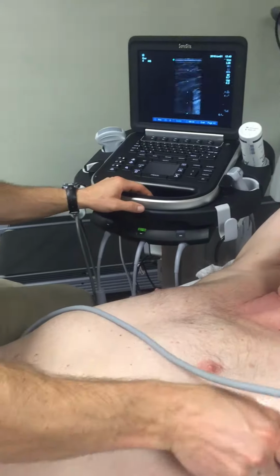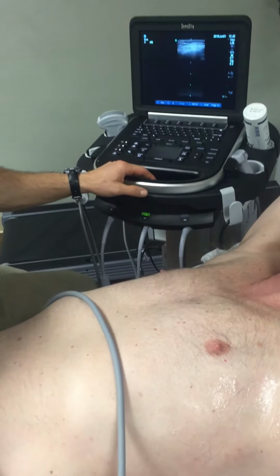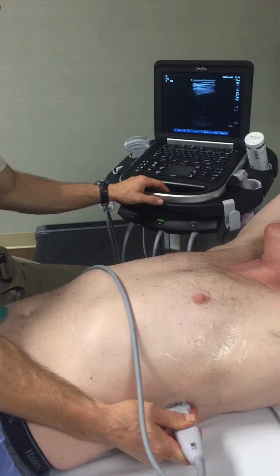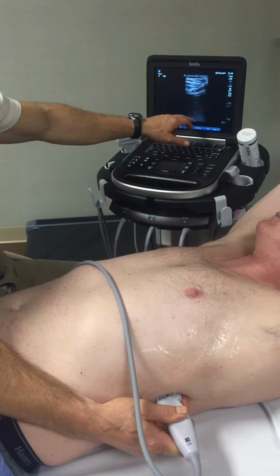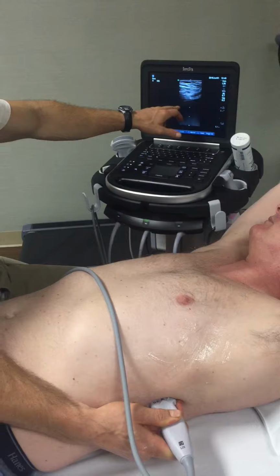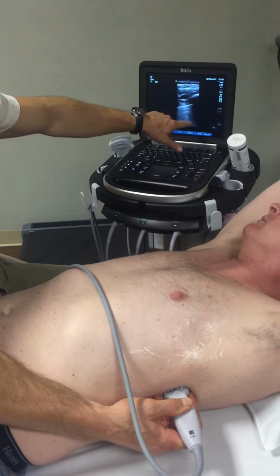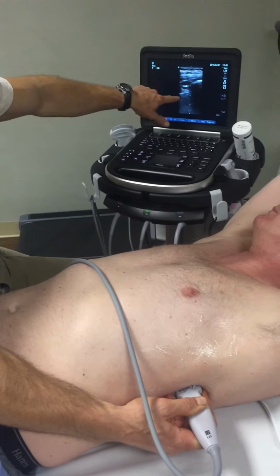And then the 4th view is usually the most dependent posterior view, and this is where you're getting the junction between the spleen and the diaphragm. This is actually the spleen you're catching here, and when he breathes you can see, and you can slide, there's the bottom of the lung. So if you saw fluid, it would be darker or anechoic here.